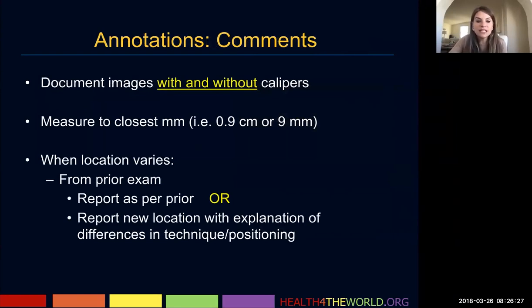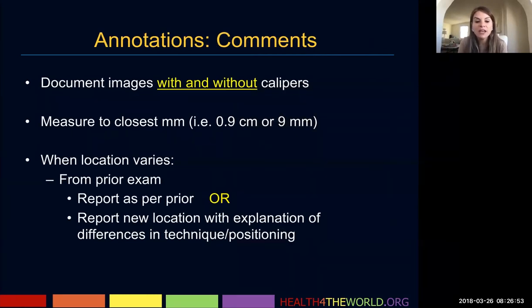For images, you want to take all images with and without calipers. If I see a mass in the radial plane, I'll freeze my image, take a picture, and then measure that frozen image and also obtain an image with calipers. Measure to the closest millimeter. If you go in for a follow-up or biopsy and the location varies slightly from the prior exam, you can report it as per prior to stay consistent, or report the new location with explanation of differences in technique or positioning.